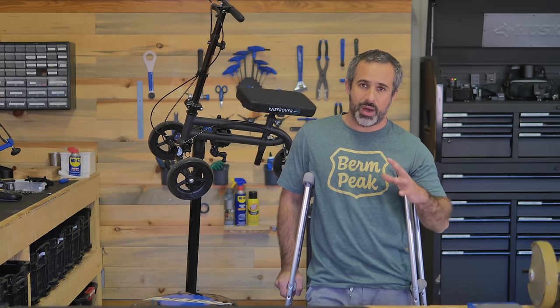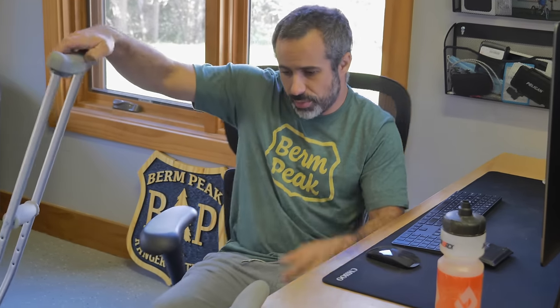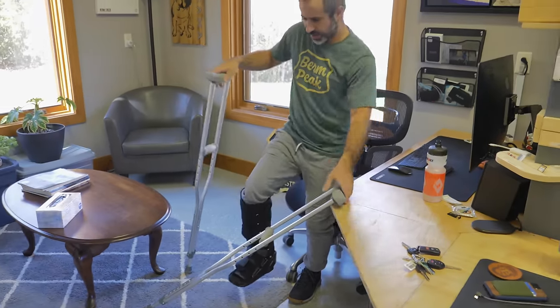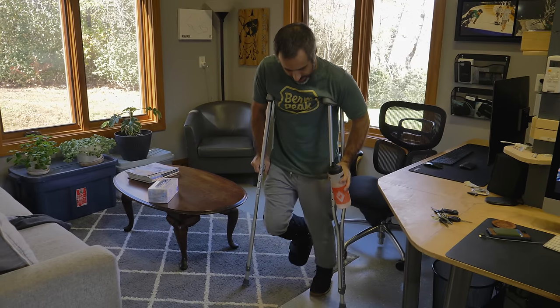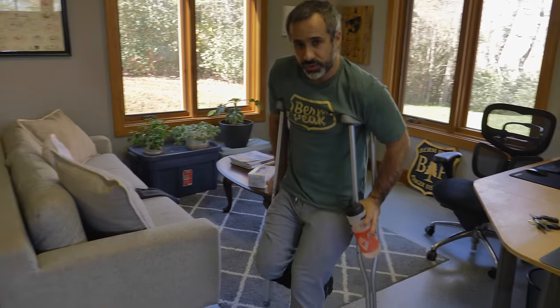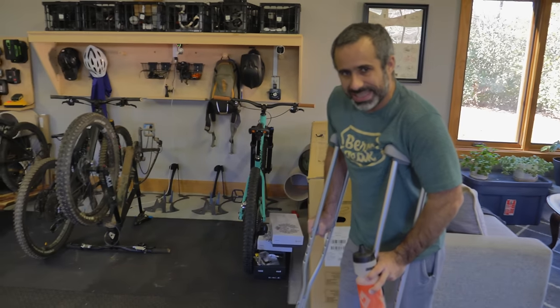First I want to show you how I've been getting around and what type of limitations I have. So let's say I'm sitting down at my computer desk and I want to get up and go over there. Crutches are easy — I put all my weight on this foot, get up on the crutches, and then I can start walking. Except if I want to bring this water bottle, what do I do? If it's anything more than a water bottle it's really inhibiting.